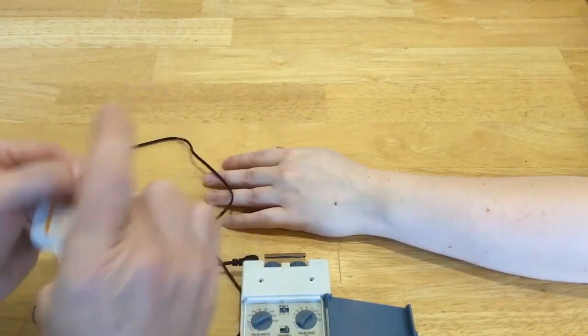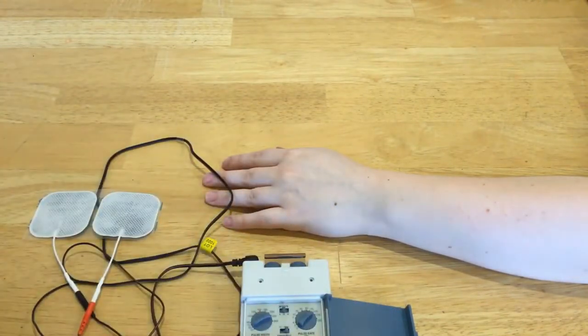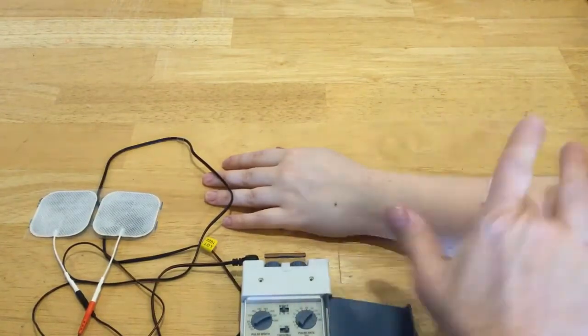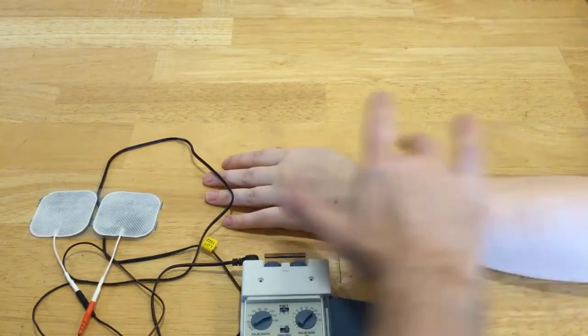First thing that you want to do is to clean your client's skin with an alcohol wipe to get off any lotions or dirt or oil that might be there. So I'm just going to do that a minute, clean that off where I might put this.